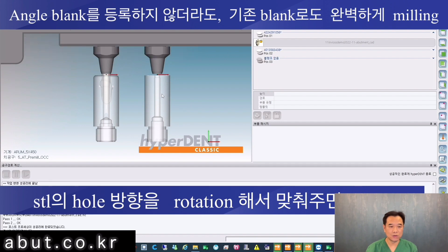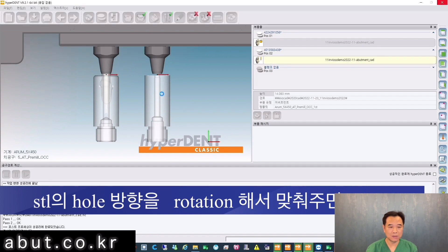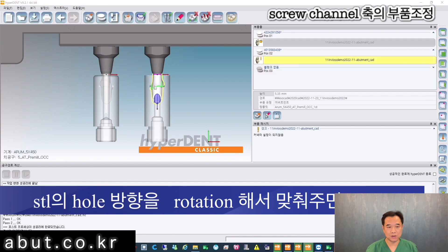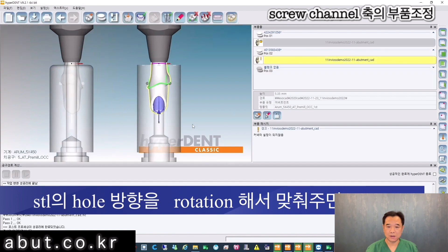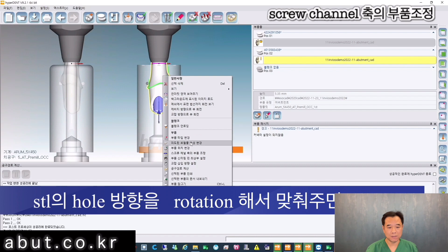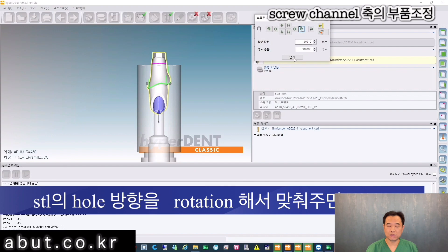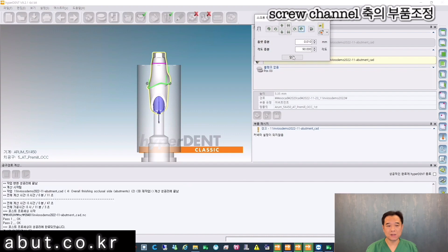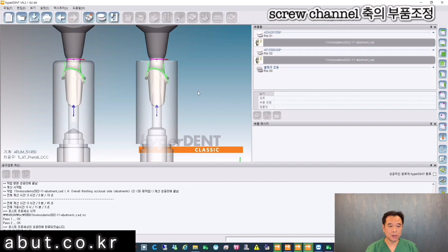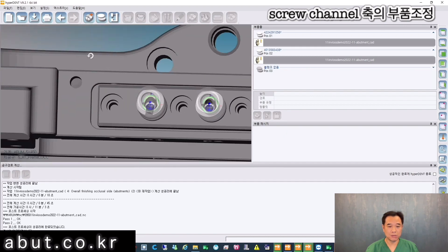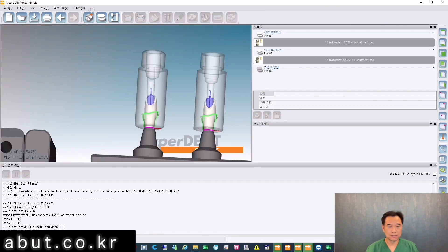Load the angle blank on Hyperdent. On the translucent angle hole of the angle blank, rotate and adjust the angle hole of the angle abutments STL file that we designed. Adjust the angle custom abutments on the milling zig and select Adjust Axis of Screw Channel, then rotate.